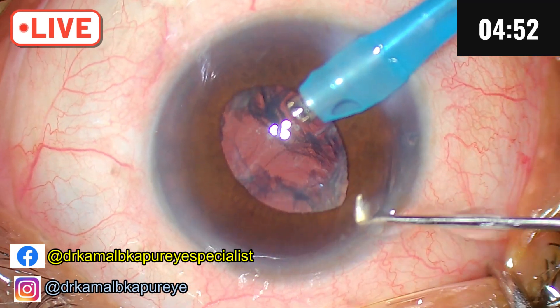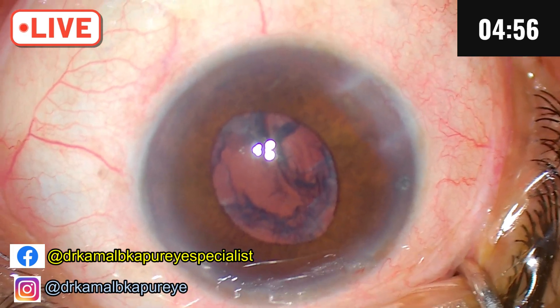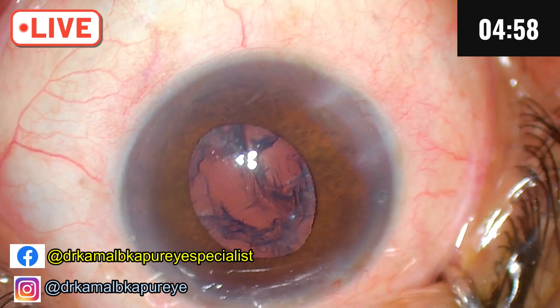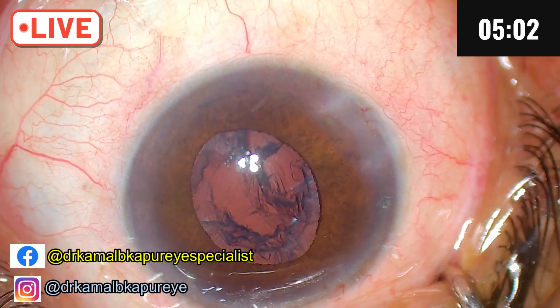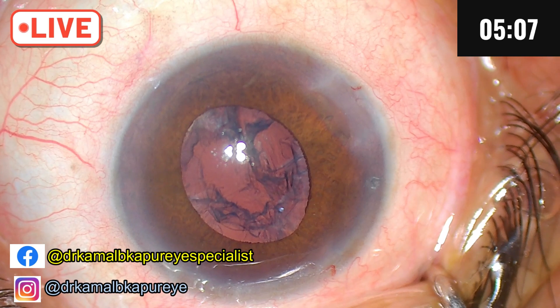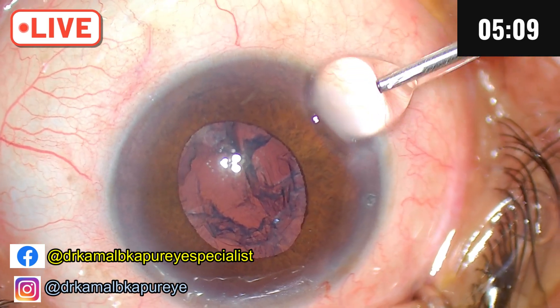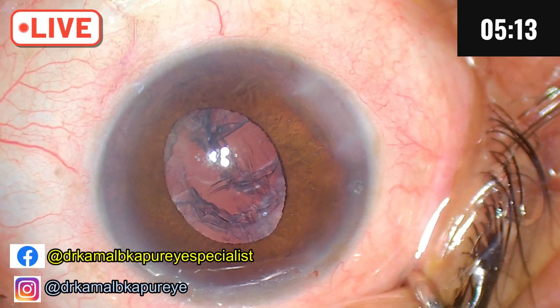As you will see, I will slowly decompress and come out. You can see the chamber has become totally shallow. While doing the irrigation and aspiration, hopefully there should be some reduction of intraocular pressure.